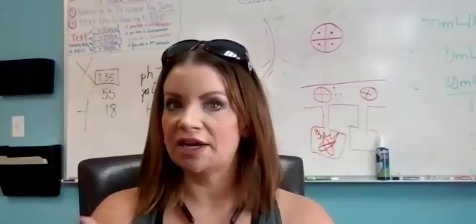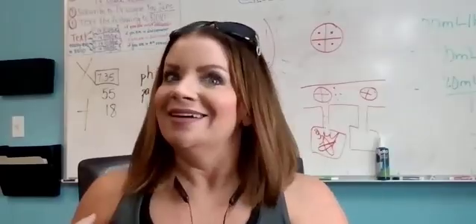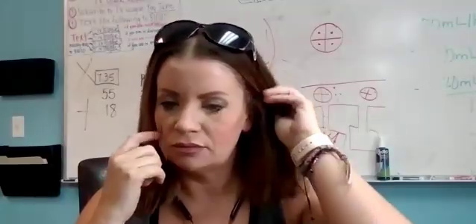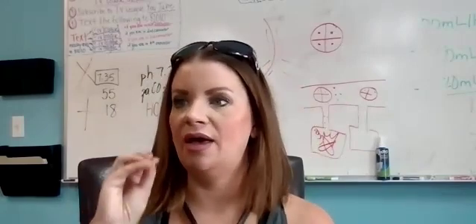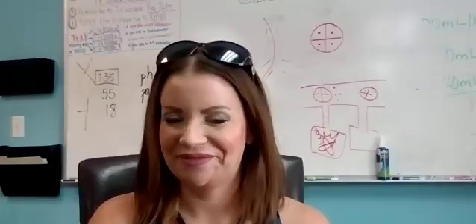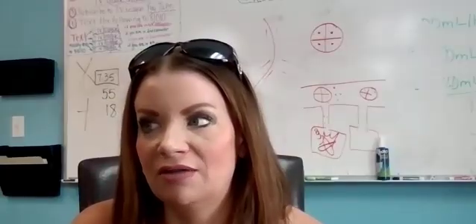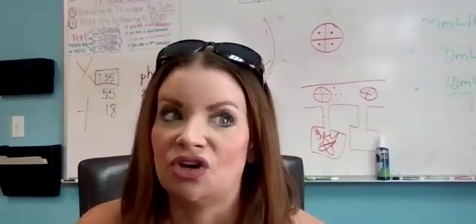Okay. Those kinds of patients are going to end up on a vent, right? And since they can't really take a deep breath, we're basically going to create the pressure for them. Does that make sense? Yes. Okay, so we would choose BiPAP if they're also having a hard time getting rid of their CO2. It helps to remove excess CO2, which is the main problem with COPD, right? They can live a little hypoxic, but they can't live acidotic.